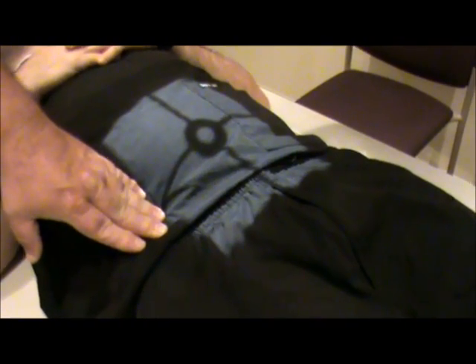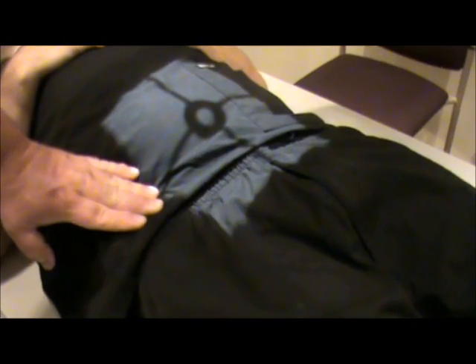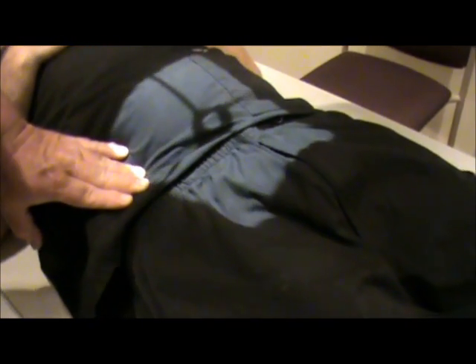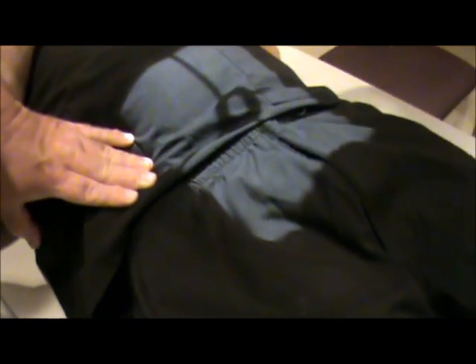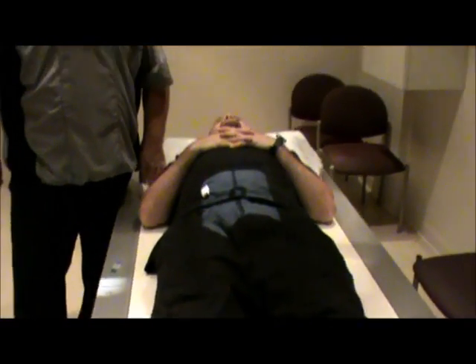It's approximately four inches from the ASIS to the symphysis, so the same centering applies for both. We're going to palpate the ASIS and go down about two inches, then center to the MSP. Collimation remains the same. You can use your marker placement in the light field as long as it's not obstructing. And this will be our AP coccyx view.